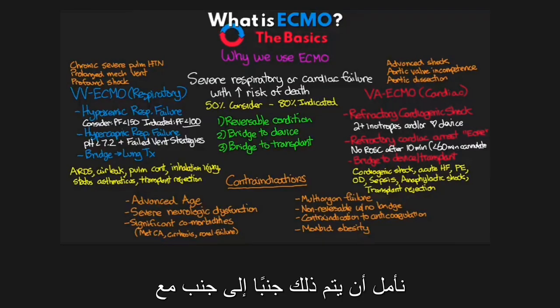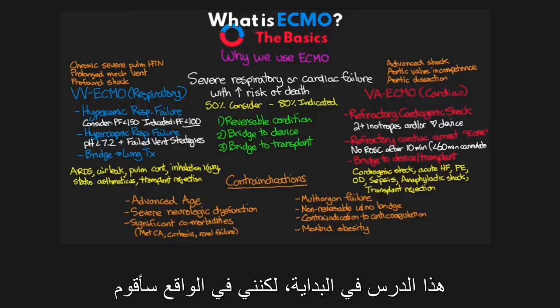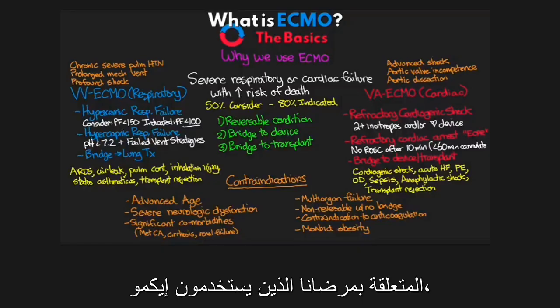Hopefully that, combined with talking through the circuit and the different configurations, makes sense. Why would we be using it? How would we be using it? And in what conditions we would find our patients that this would be potentially beneficial or would really prevent them from being able to get this therapy. I was initially going to include it in this lesson, but I'm actually going to make a separate lesson specifically looking at some of the basic physiology that's related to our patients on ECMO.